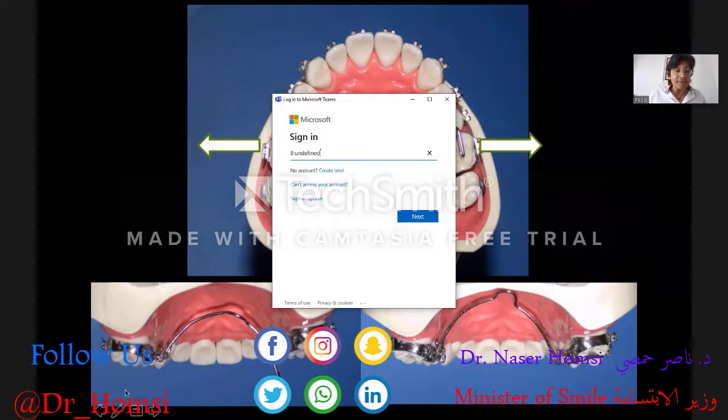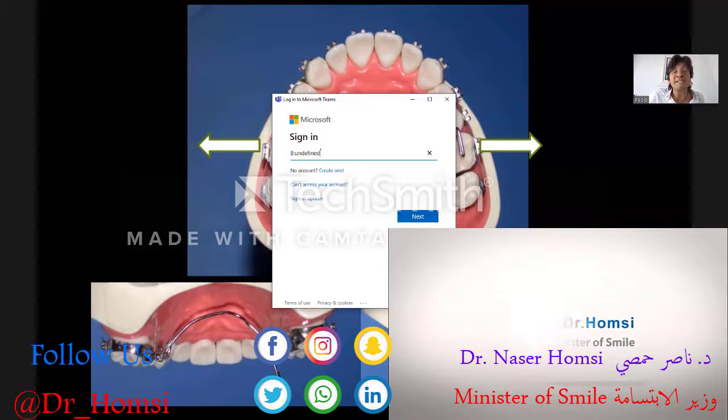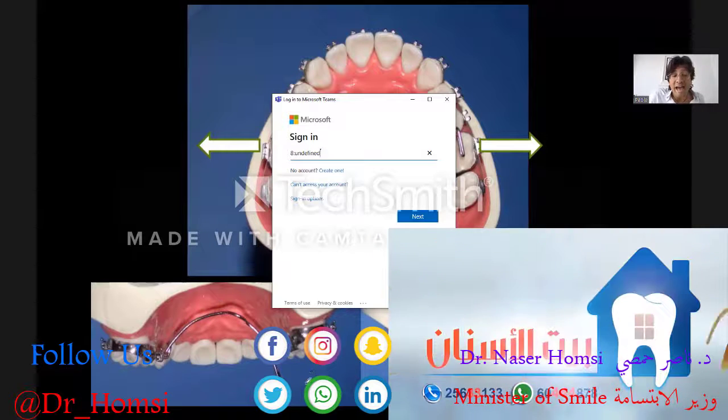Now, what happens when we expand the transpalatal arch? The expansion is always bilateral expansion, and so you cannot split because it's only one appliance on two molars. So how is it possible to split the force or to increase the anchorage on one side? To increase the anchorage on one side, we can add to this kind of expansion a kind of activation: a negative torque on the side we don't want to expand. Negative torque means extrusion on the side of the expansion.